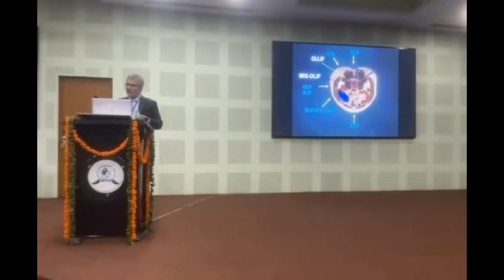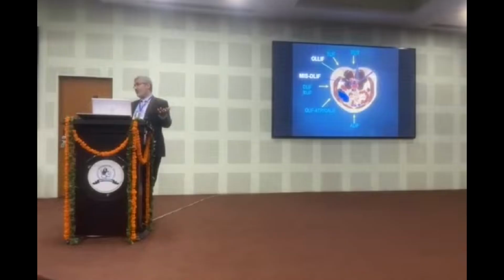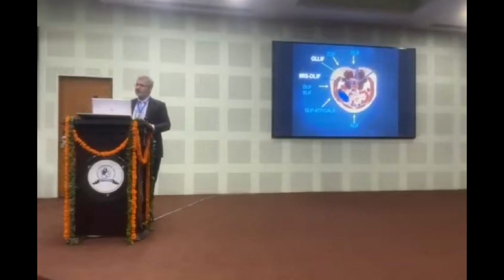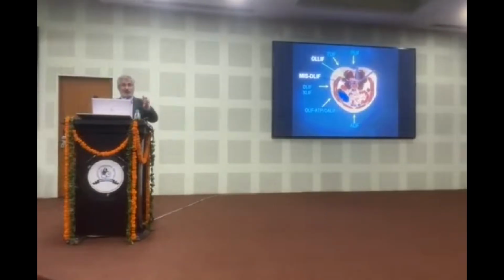There are three ways of doing that. Dr. Java and my good friend Dr. Mazhavada use an endoscope. They look at that area, they make sure where they're entering the disc, there is no nerve. And that version is called PALIF. The fully endoscopic version of the surgery is called PALIF. As a matter of fact, that was the first thing that came on. The people then later on decided not to use the endoscope. Then how else can we respect the nerve?